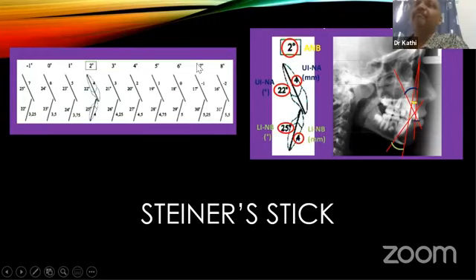And if the alveolar bone surrounding the root of the upper incisor is very thin, especially now that we have CBCT, we can show this actually happens. The root actually comes out of the alveolar bone, and if we torque the incisors even more, there is a risk of the root coming out of the bone. So my limit for ANB will be about 6.